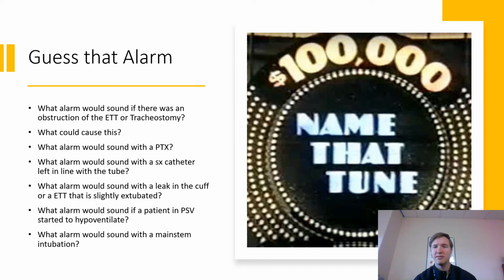A lot of secretions can be jarred loose when you're taking these patients to CT scan or MRI or interventional radiology, you name it, nuclear medicine, right? Any of those places, when we're bouncing around, we're going up and down elevators, right? When we're changing their position, switching them from the bed to the CT scan and then back again, right? All those bumps and all those changes could easily cause some stuff to come out.